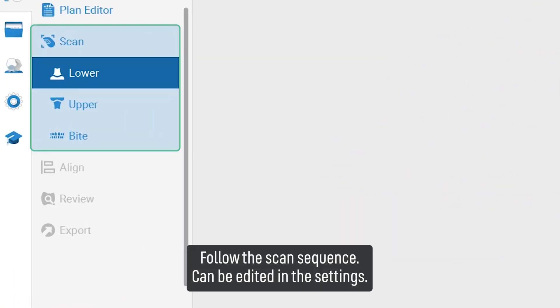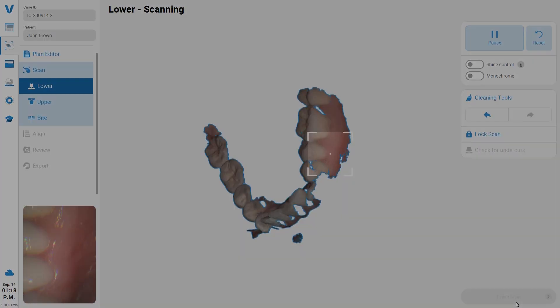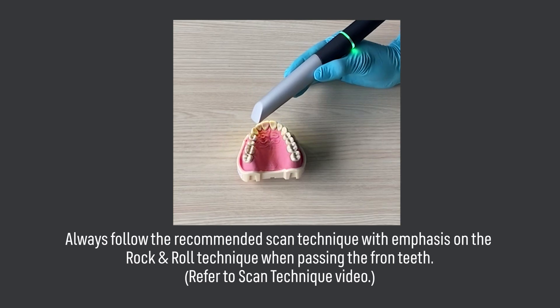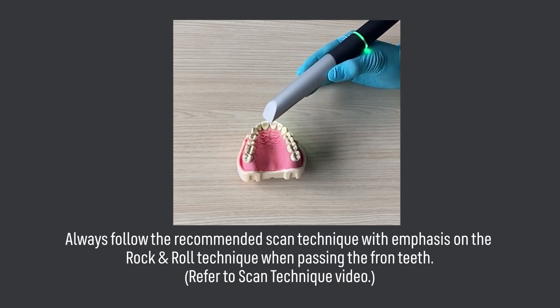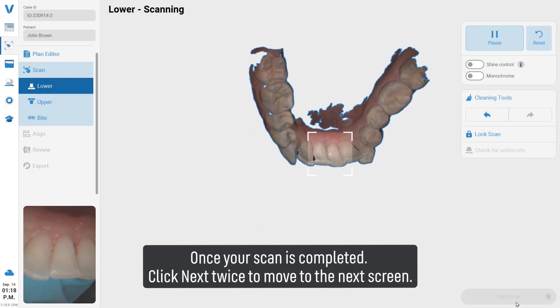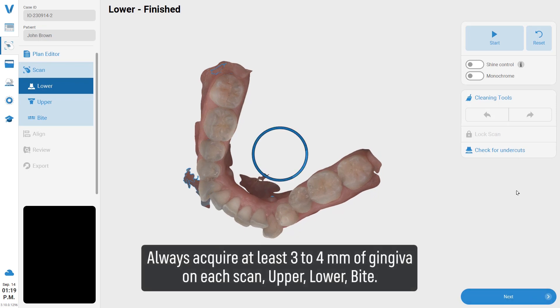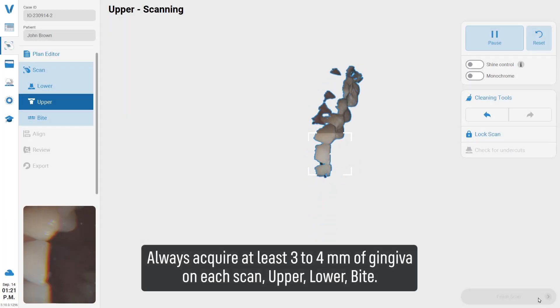Follow the scan sequence, which can be edited in the settings. Always follow the recommended scan technique, with emphasis on the rock and roll technique when passing the front teeth. Refer to the scan technique video for guidance. Once your scan is completed, click 'Next' twice to move to the next screen. Always acquire at least three to four millimeters of gingiva on each scan.